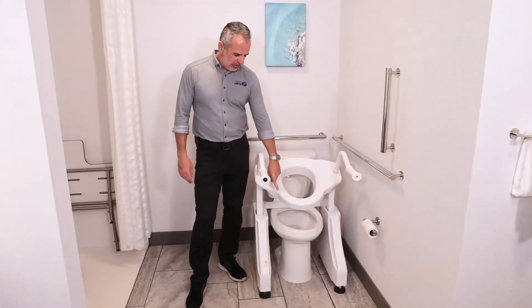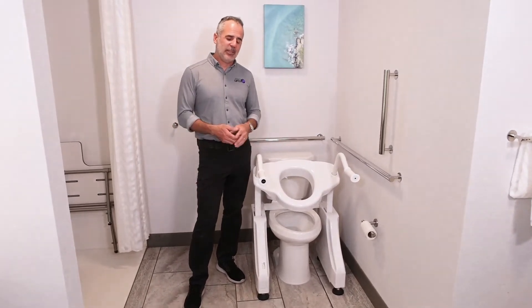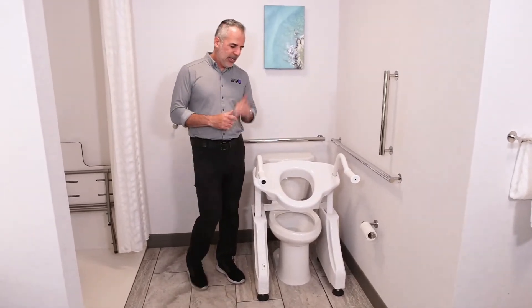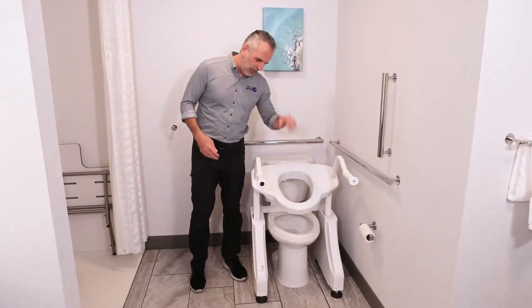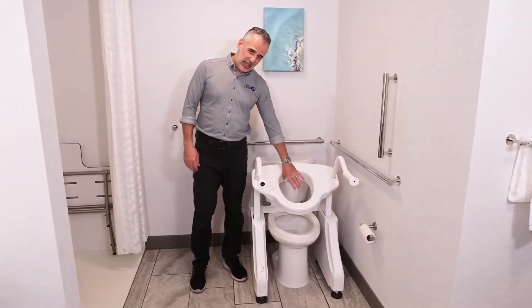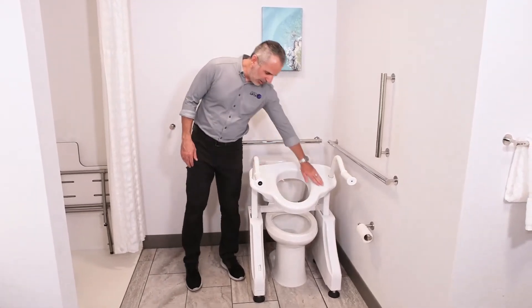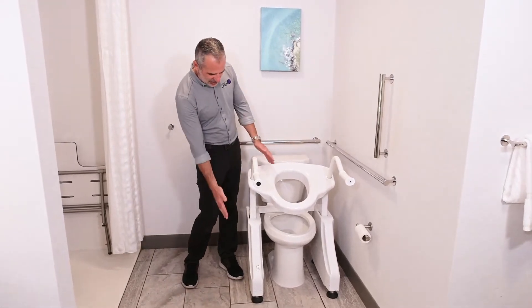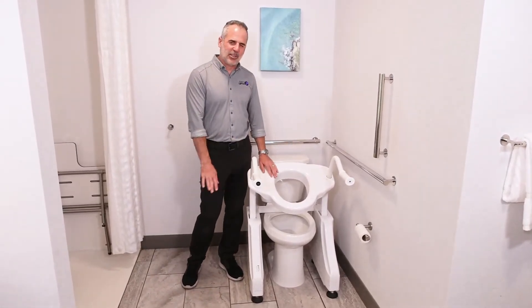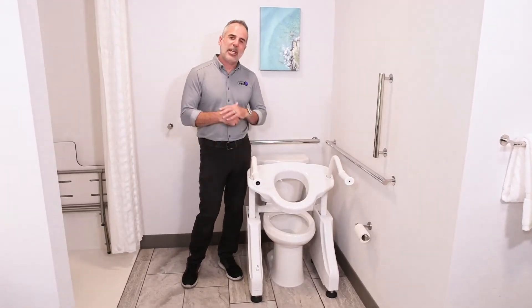It works with toilets that have a rim height from 14 inches to 18 inches, which is most toilets — it's very adjustable. The DL1 has a sanitary chute, so almost everything will end up in the toilet bowl. It also has a one-piece deck, so it's easy to clean. As you can see, it's a nice simple appliance-looking device. It's not difficult to clean and it's not awkward looking in your bathroom.